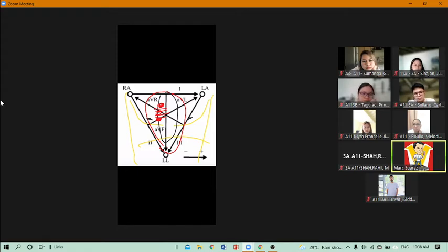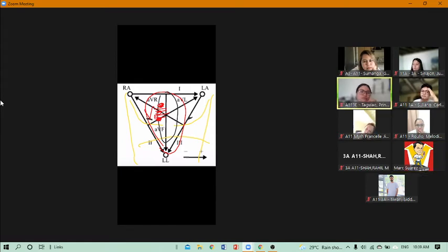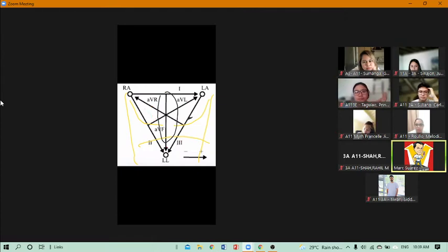Fourth intercostal space, right sternal border. So this will be V1. V1 is here. Follow? So nipple.